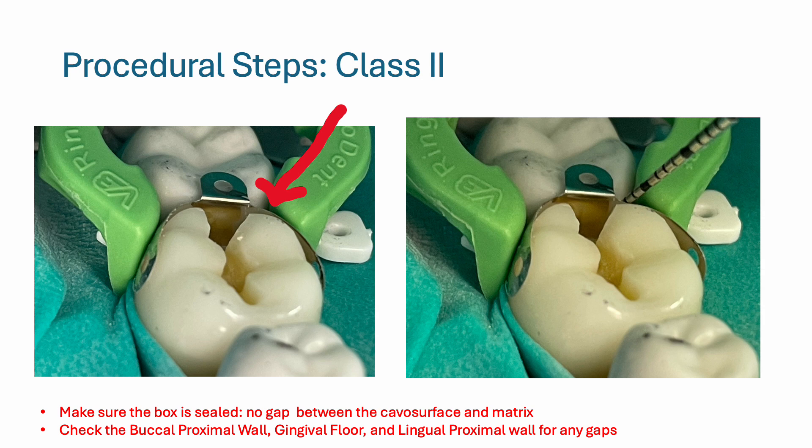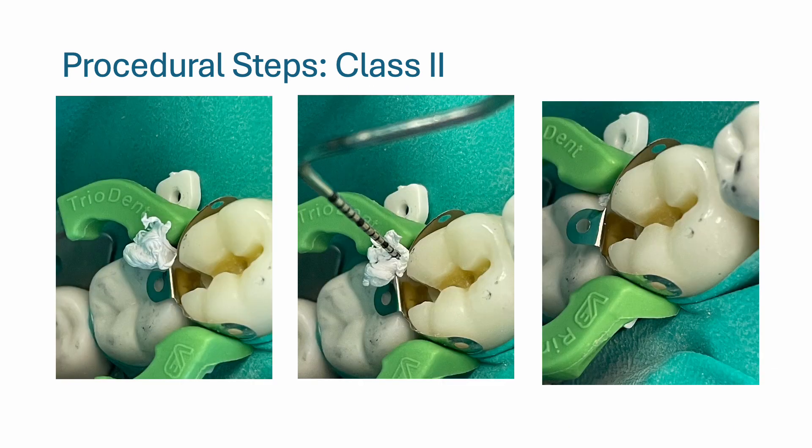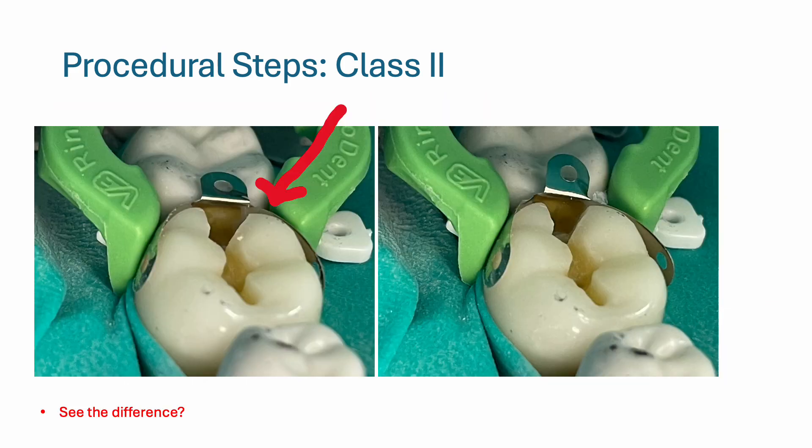Here I have a red arrow pointing to a gap between the matrix and the tooth. To seal that gap, you can either make a cotton pellet with a cotton roll or use some teflon tape. I made a little ball of teflon tape and stuffed it in with a perio probe to seal the gap between the matrix and the tooth — the box is now sealed. When you do this, make sure you have not lost the proximal contact, so you may have to re-burnish.